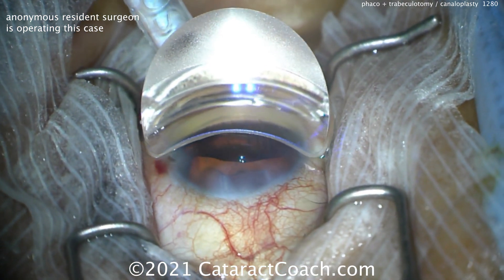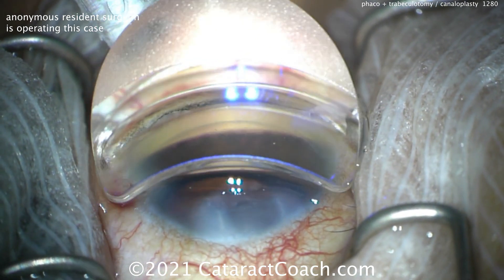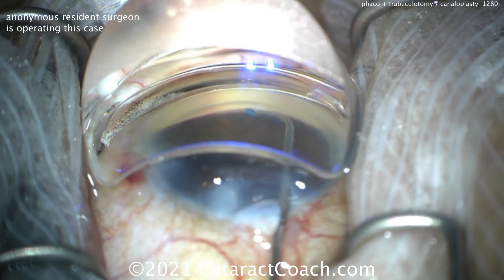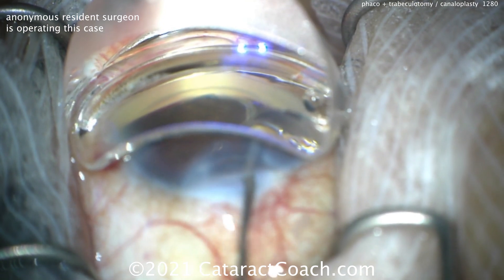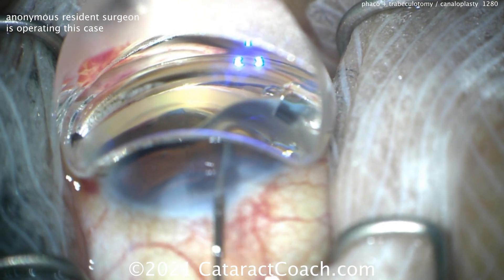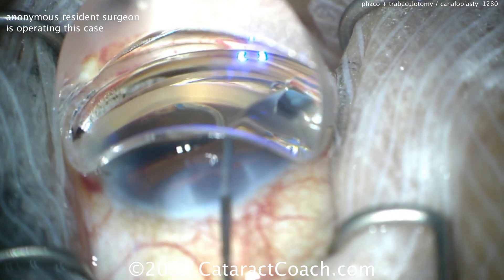And if you don't have enough of a view of the angle, tilt the head more away from you, tilt the scope towards you more. Make sure you're gentle and don't compress that cornea. That's beautiful angle anatomy. So once that's done, the device tip can be gently placed inside the eye. You're going to enter and then pass the filament by using the spinner wheel on your right index finger. The total length is about 180 degrees, so it'll go across as you feed it through. And as you retract it, it automatically puts viscoelastic to do the canaloplasty.